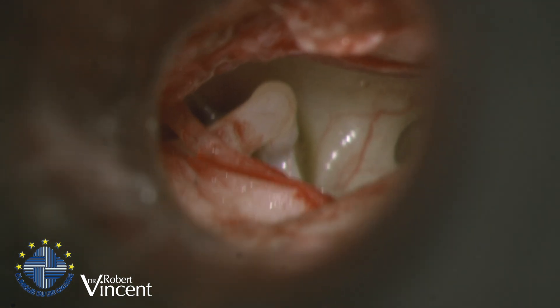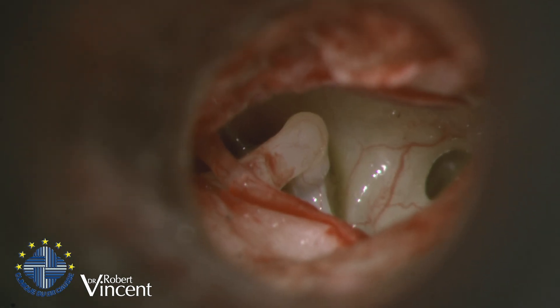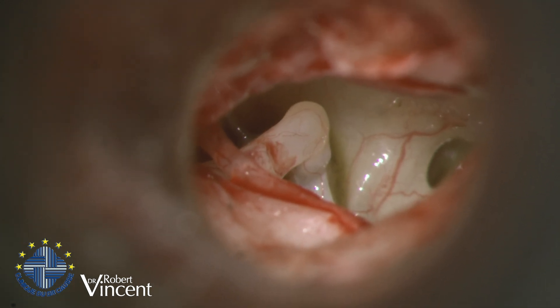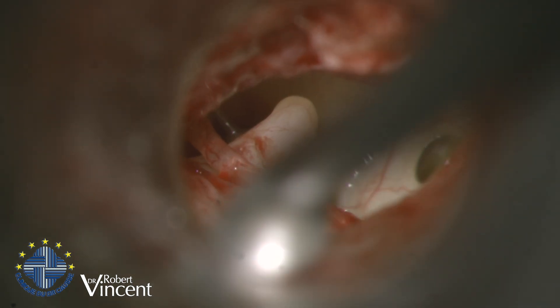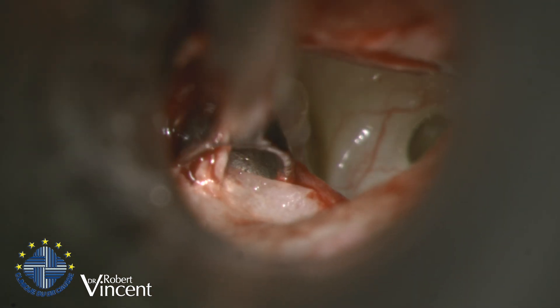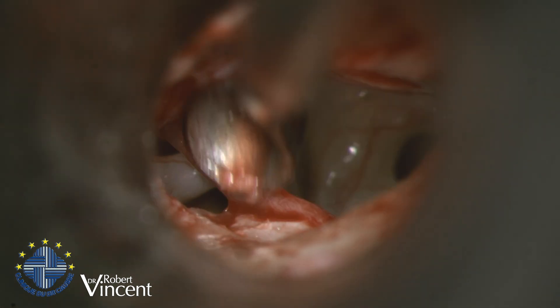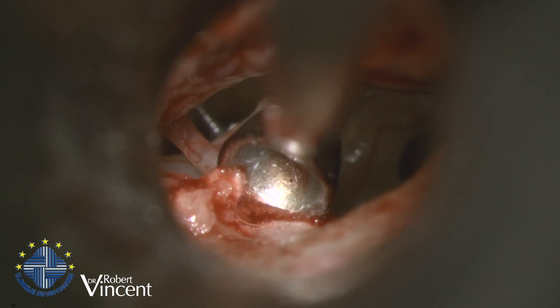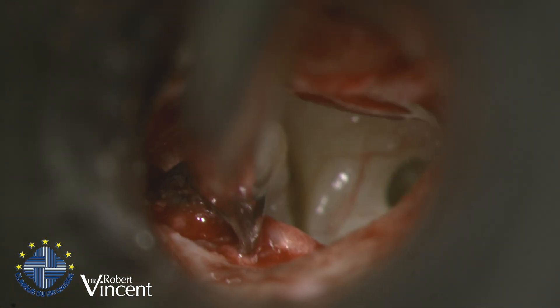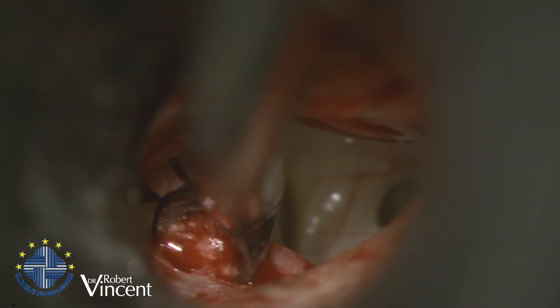What we need to do now for the next step is to have a clear, safe exposure of the facial nerve and the lenticular process of the incus. In order to have a clear exposure, I will use the curette to resect the bone of the canal and expose the main landmark, which is the facial nerve to the left. Here we can see the facial nerve now beginning to appear.